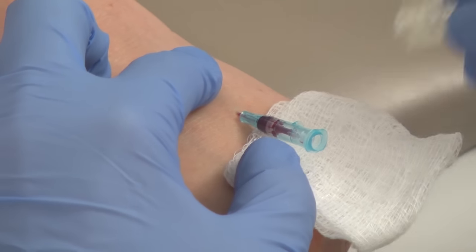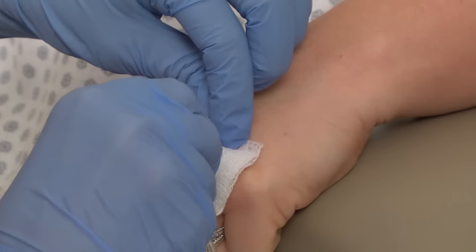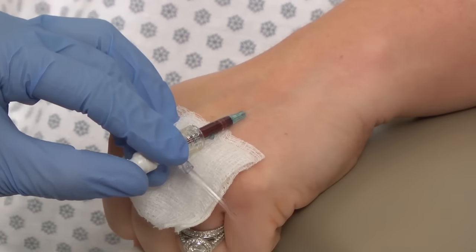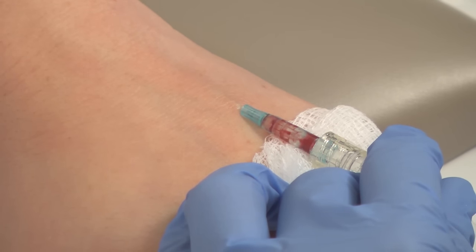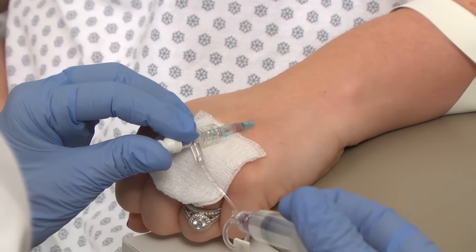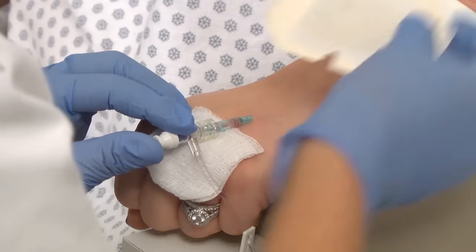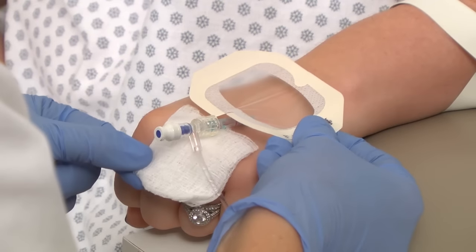Apply the saline lock by twisting the saline lock onto the angio. You can place a piece of gauze underneath to catch any blood, then flush with saline. While flushing, observe the site for any redness or swelling. Watch the patient for any signs of pain and ask them if it feels okay. Remind them that it may feel cold but should not hurt. If there is no swelling or pain, secure the angiocath with a transparent dressing.